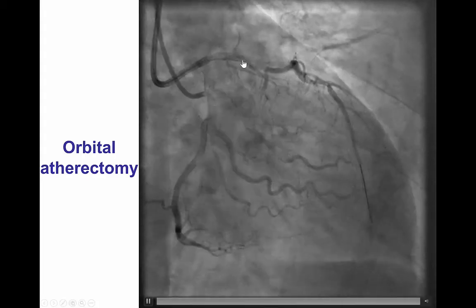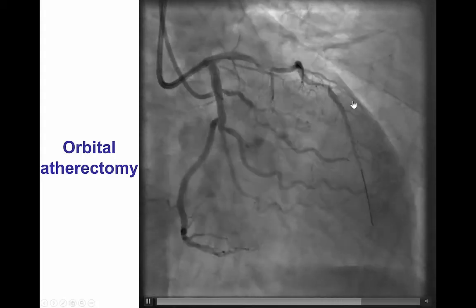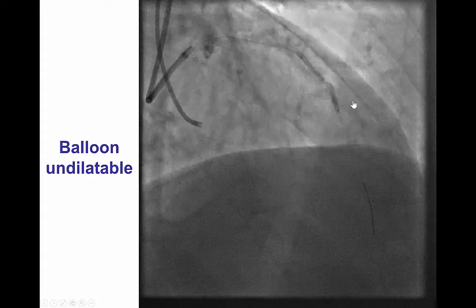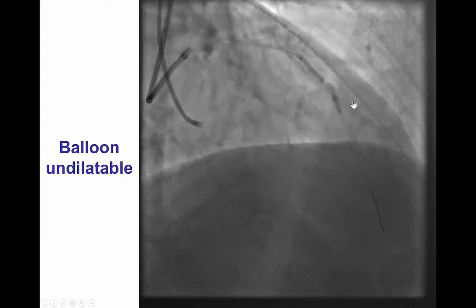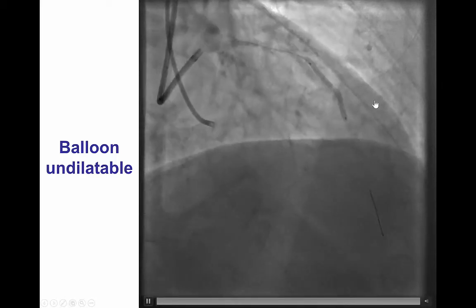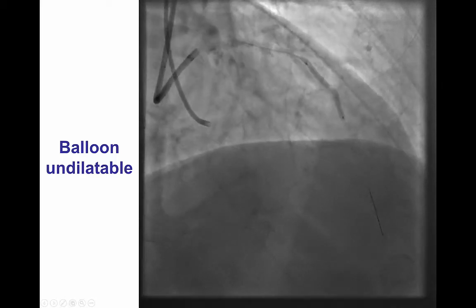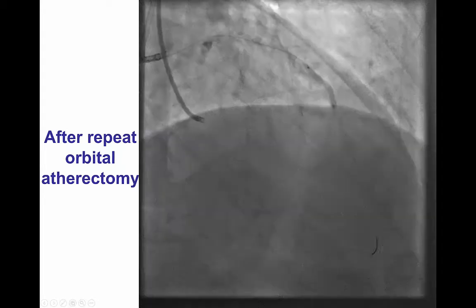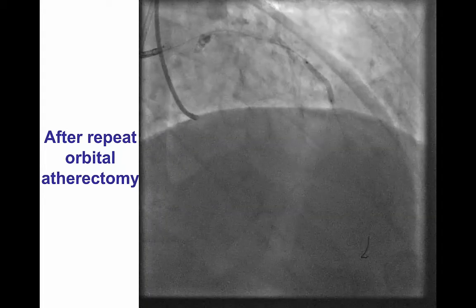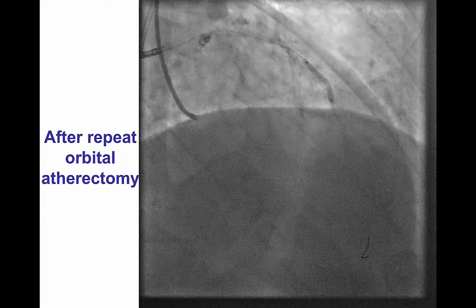This may have caused a little dissection in the proximal and mid-vessel. Despite doing atherectomy, when predilatation was performed, there remained a significant waist in the balloon in the mid-LAD. That is why the atherectomy wire, the Viper, was reinserted and the patient underwent repeat orbital atherectomy, after which the mid-LAD lesion was nicely expanded.